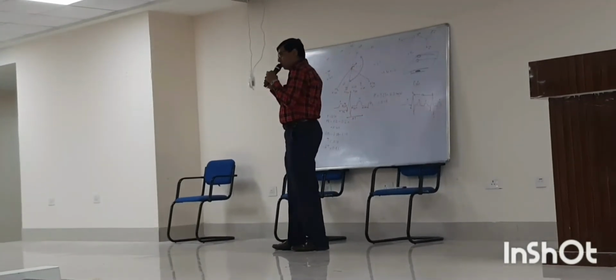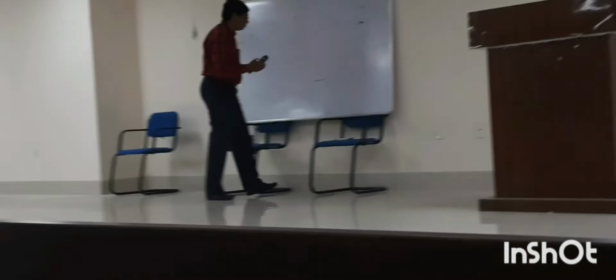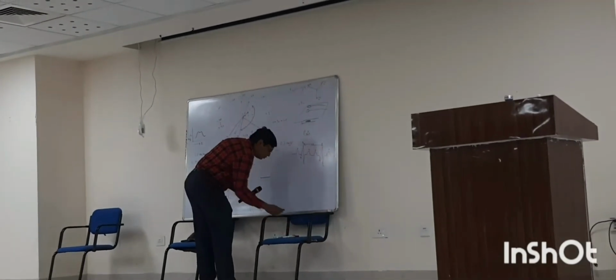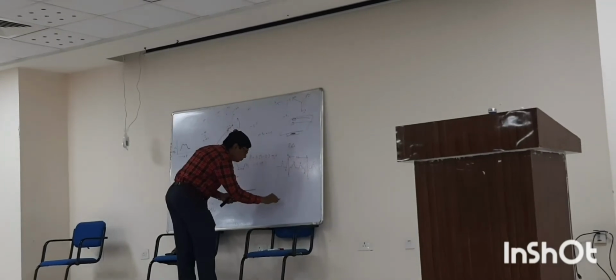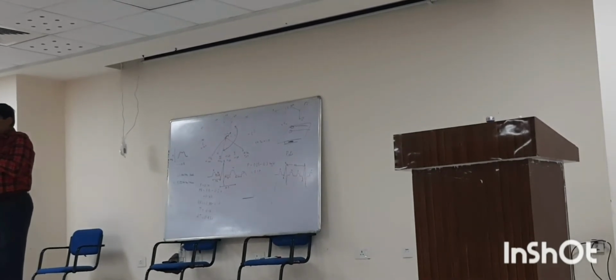If it is more, it is prolonged. A prolonged PR indicates first degree heart block.